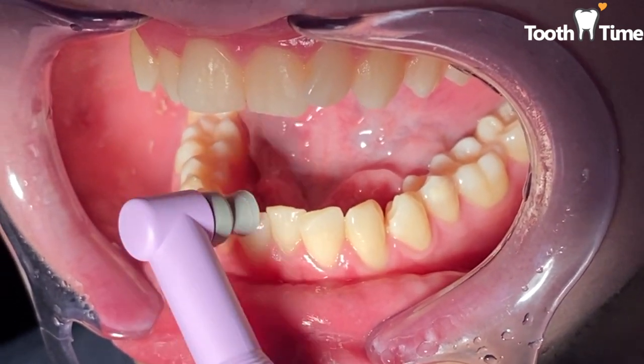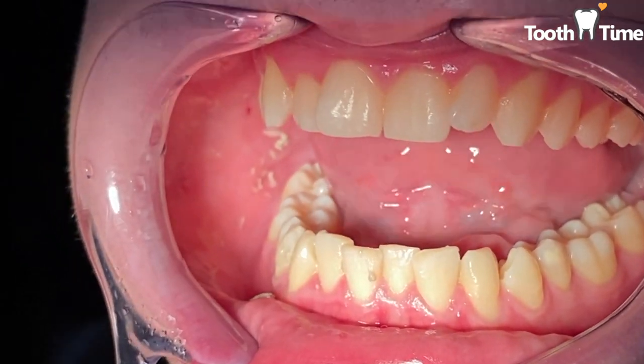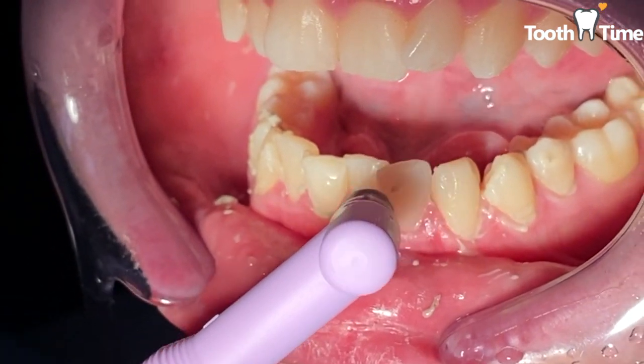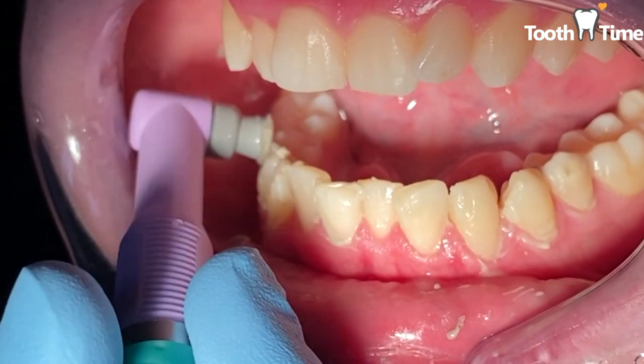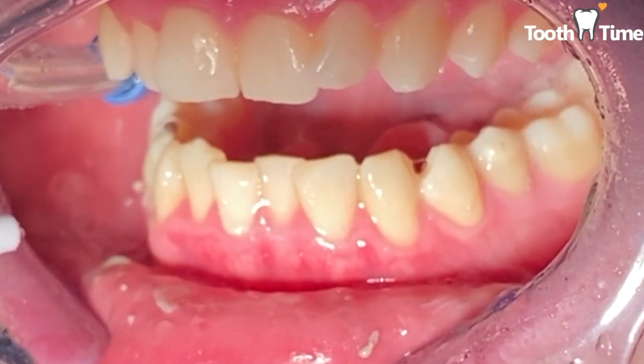And when we scan, we can keep that for our records, but also we send those records to the clear aligner company where they make the clear trays and then they send them back to us. It's also a much faster process to get in the trays. Instead of having the patients wait maybe 2 months for their clear aligner, sometimes they wait 3 to 4 weeks.